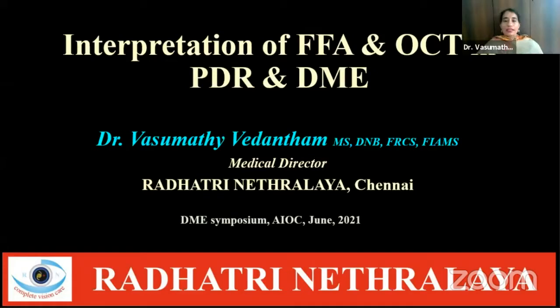Okay, so it's the interpretation of FFA and OCT in PDR and DME, and I thank the All India Ophthalmic Society for giving us the opportunity to present our experience in this.